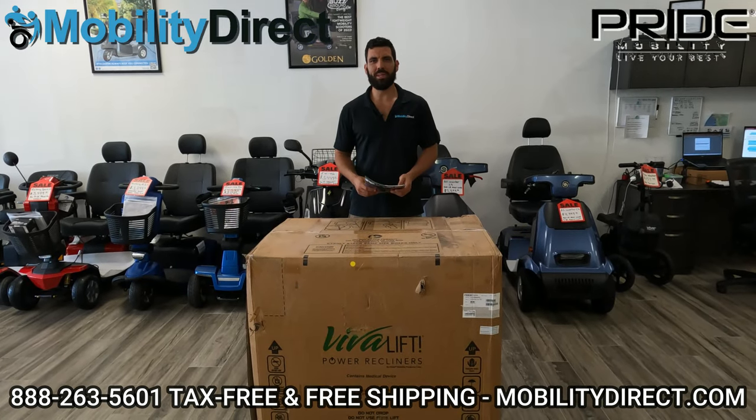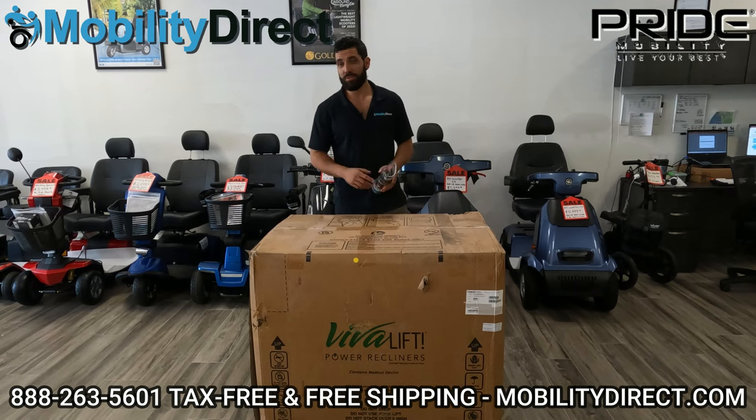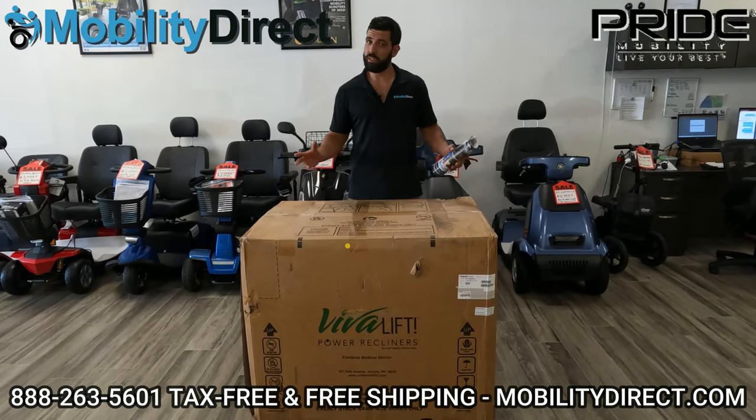Hi everybody, I'm Sergio with Mobility Direct and welcome to our YouTube channel. Thanks for stopping by. In today's video, we're going to show you how to unbox and assemble the Radiance Power Lift Recliner, also known as a lift chair.